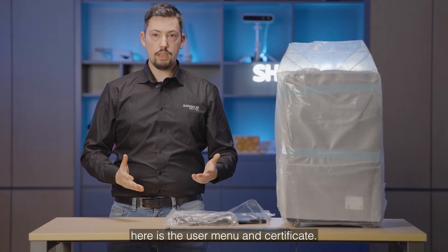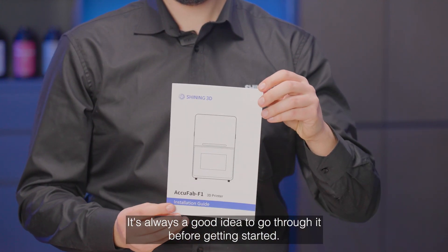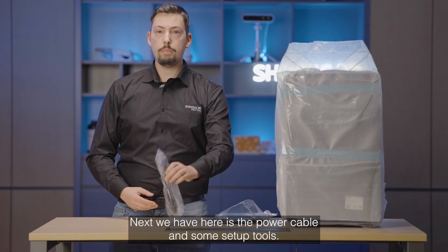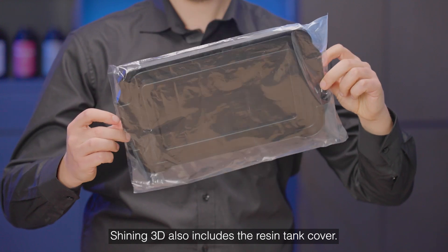The first thing that we see here is the user manual and certificate. It's always a good idea to go through it before getting started. Next we have the power cable and some setup tools. Shining3D also includes the resin tank cover.